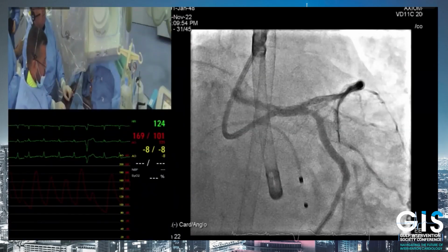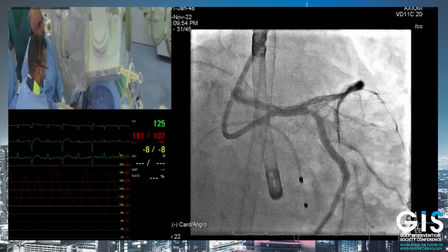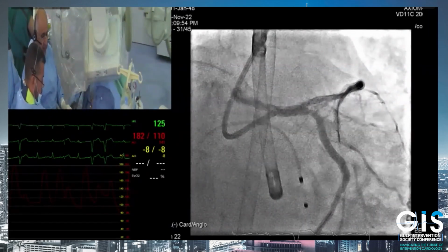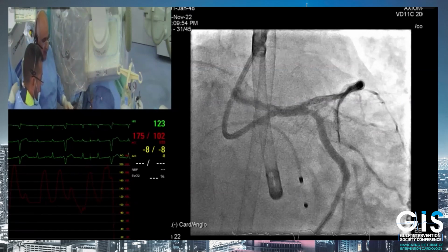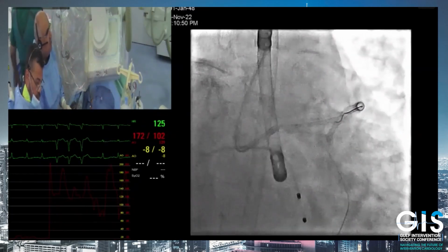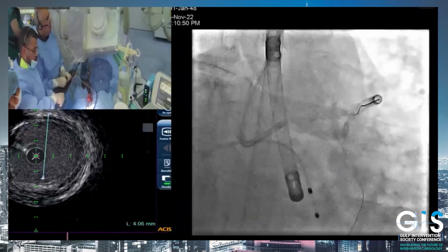Arif, can you explain again what's the size of the proximal LAD and the size of the left main on your imaging? Left main, I could tell 5. Distal, mid LAD measured was 3 to 5, but we can show you the imaging again. And Dr. Arif, how many shock wave runs did you do? I gave 9 runs, sir, from mid LAD, proximal, and ostial.